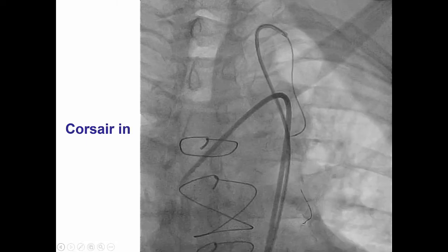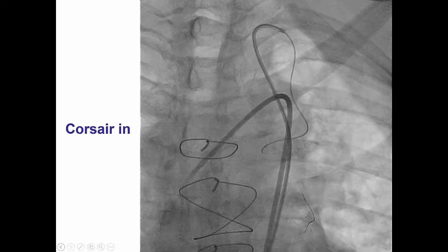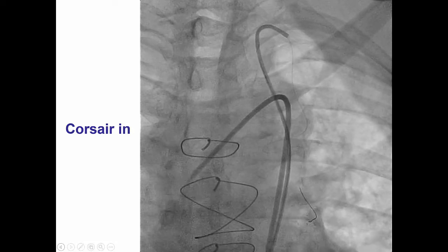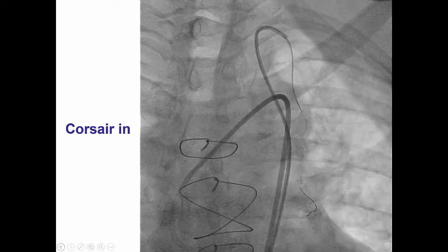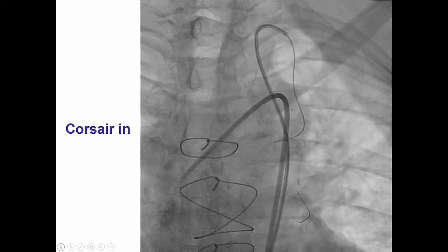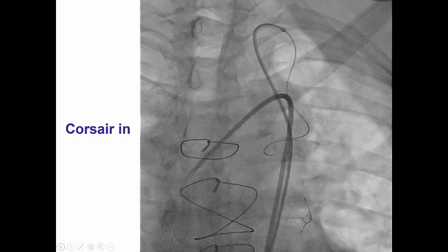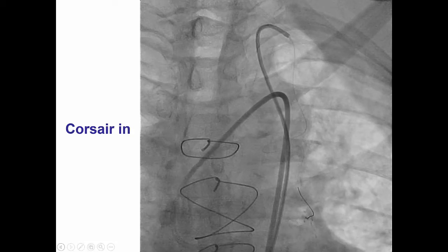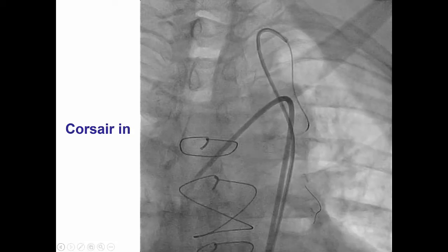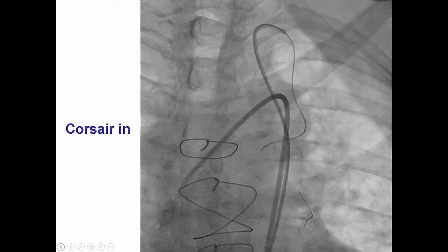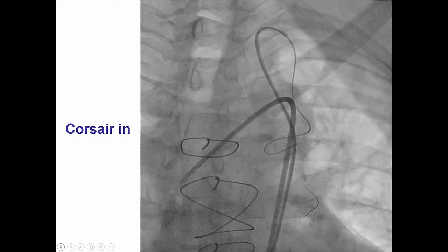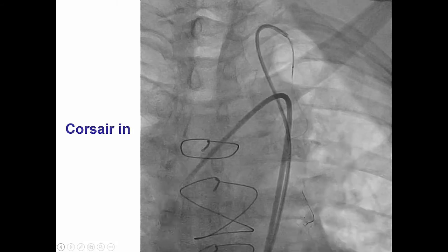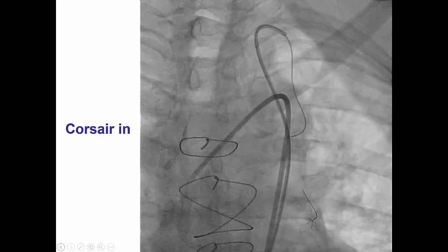When the LIMA is used, especially when it's the last remaining vessel like in this patient, it is very important to ensure that we don't compromise flow through the LIMA during retrograde crossing attempts. That can happen because advancing wires through the LIMA can cause straightening of the tortuosity and pseudolesion formation, compromising flow. So we first inserted a soft guidewire and waited a few minutes. The patient did not have any chest pain or EKG changes.